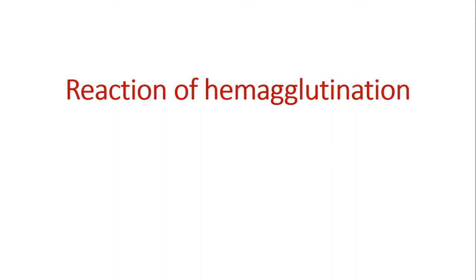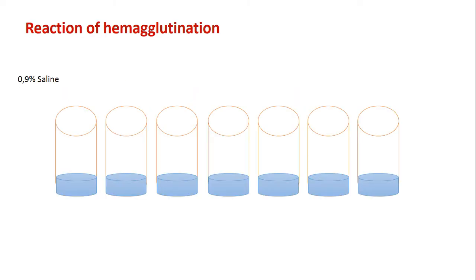Reaction of hemagglutination. Hemagglutination serves as a convenient method for detection and assay of the influenza virus. For this reaction, we use test tubes or special plastic trays. We add 0.9% physiological solution into all test holes.